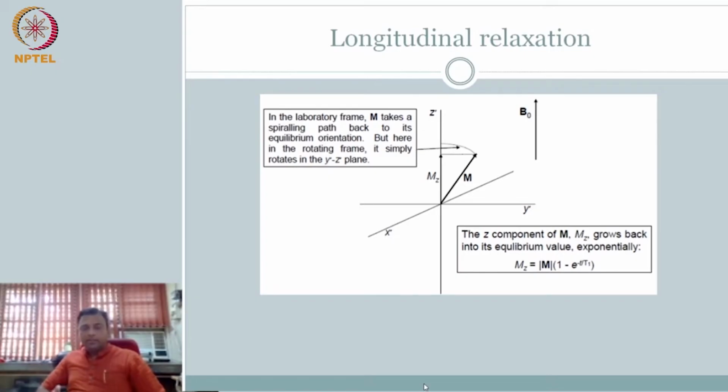And the reason for that is we are just going to complete one important concept that is related to the T1 and T2, T2 star that we were talking about, and to do with recording the signal, right? Your decay signal in relation to application of excitation pulse. What we covered so far is if I apply pi by 2 pulse, I get the maximum signal, and all our illustrations that we have shown, we have pushed it to the floor, allowed it to dephase, record the signal, and this is a T2, T2 star, T2.